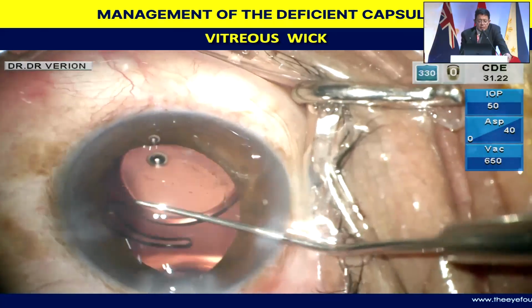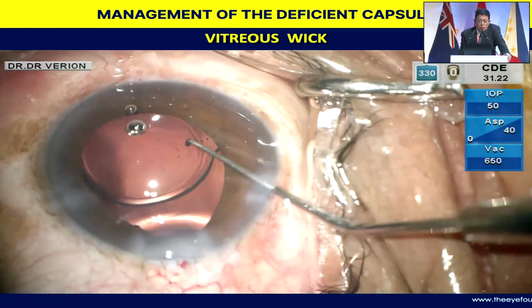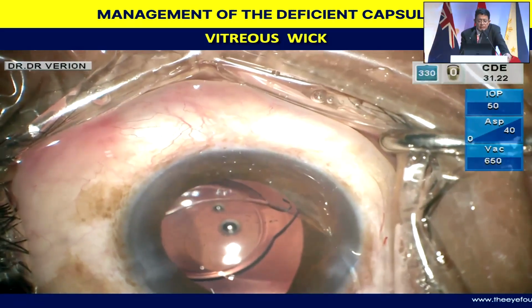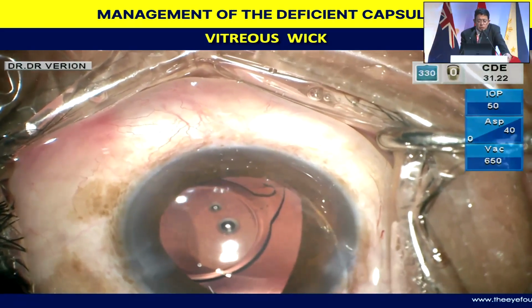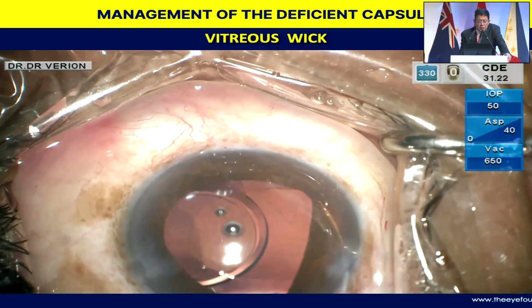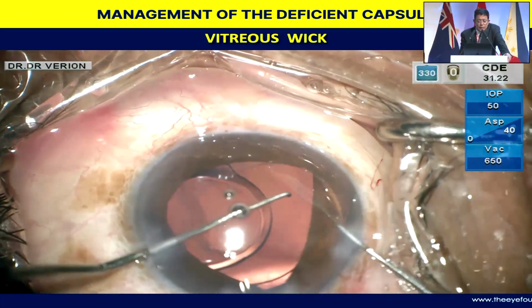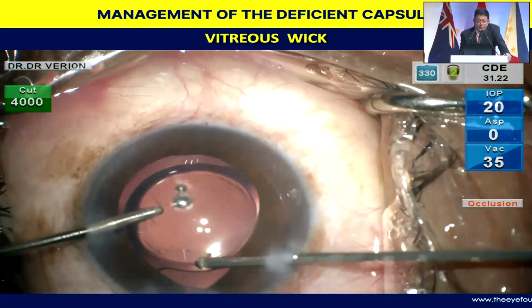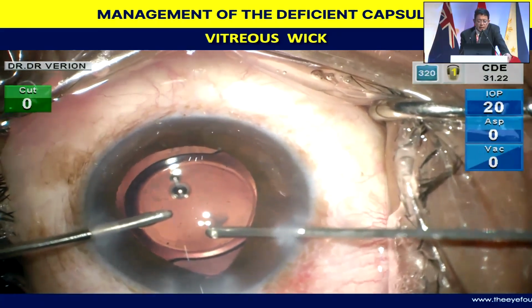So essentially the patient was to receive a single piece lens. So I go ahead and inject it. You can see already the vitreous popping out here. And then I inject an endocapsular ring in place. This was maybe the trauma of the surgery, because it was not a pre-existent problem. So it's not a progressive zonulopathy that we have, but I just want to give enough circumferential support. So go ahead and inject an endocapsular ring.